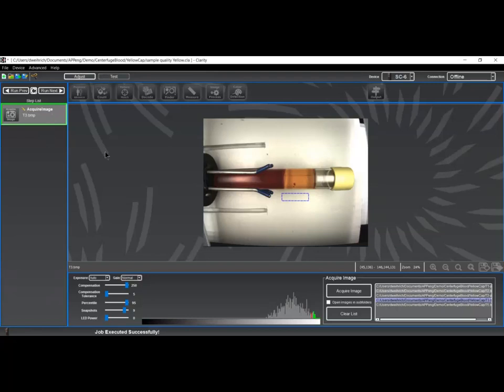The first step, of course, is to acquire an image. These controls down here are direct hardware controls that control the acquisition process in the camera. There's some iterative work that has to be gone through to get these settings correct for the best uniformity of picture-to-picture and the best utilization of the illumination. It should be noted that the most critical part of machine vision operation is the lighting and illumination around the object.